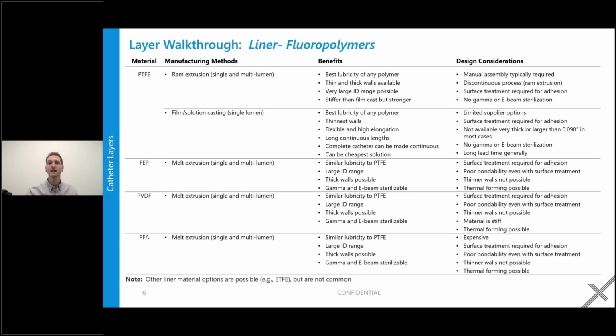Etchant doesn't last forever. As soon as you start to create that surface energy, oxygen and other things try to bond to it, and so it wants to get back to an inert state. And so PTFE does have a shelf life, and how you package that extends or reduces that shelf life.